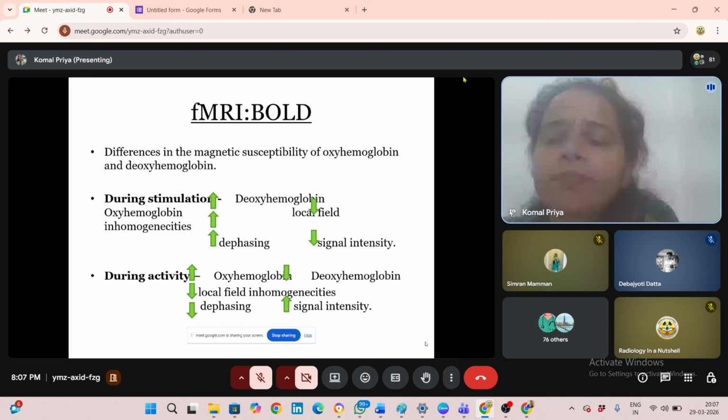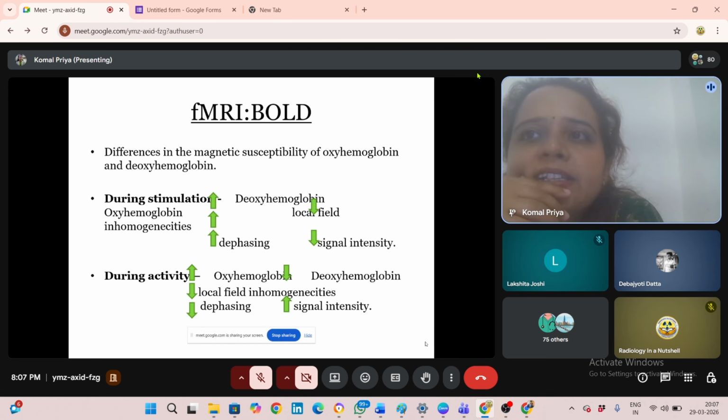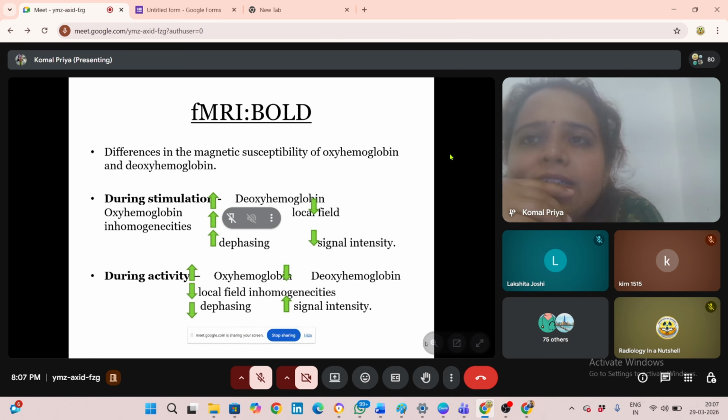To exploit that, we use the T2 star effect, or BOLD images, with a long TE. TE is your time of echo. That is the time taken from the, what is TE? Time of excitation? Can you define it? What is echo time? Time of excitation? Are you sure? No, ma'am. Echo time.